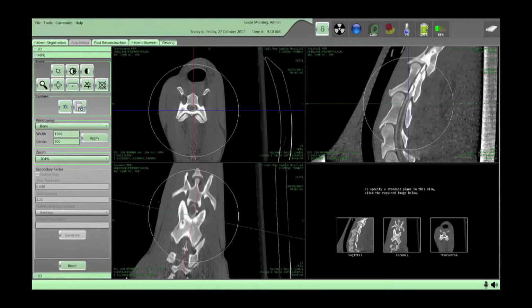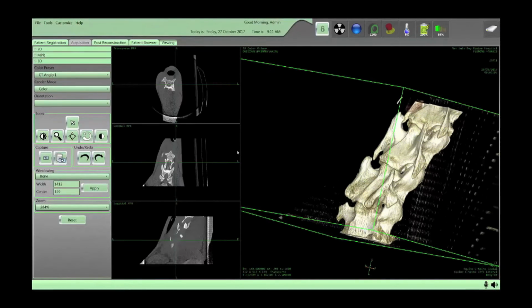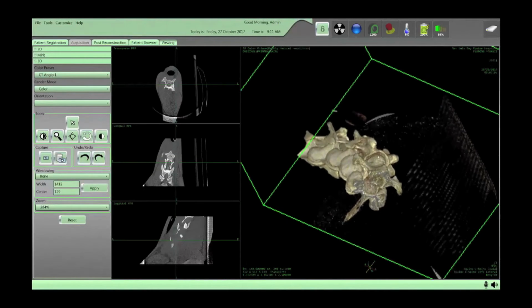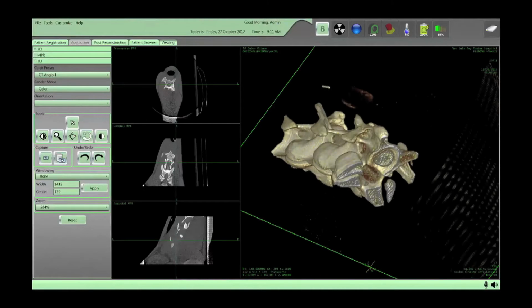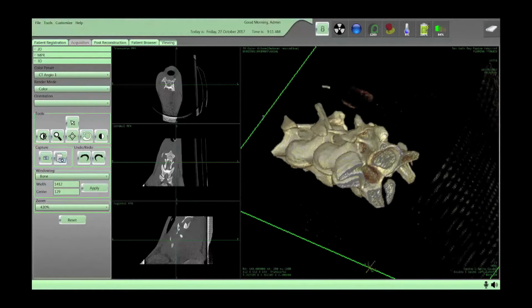With the diagnostic imaging being high quality, we can see images all the way back that show us unique pathology. So we're able to see bone cysts, spinal cord compression, enlargement of the cervical facets, especially if there's a unilateral component. The majority of the cervical spine pathology has already been shown to be in the caudal cervical spine. So being able to uniquely see in 3D back at that level has been a huge push for the clinic, as well as for an advancement for spinal imaging in horses.